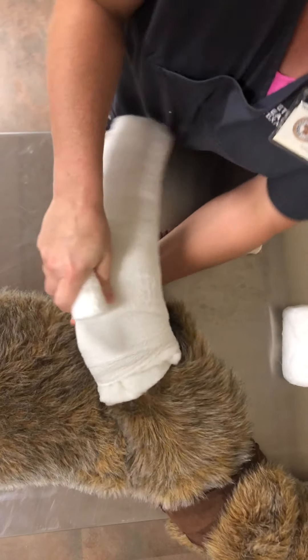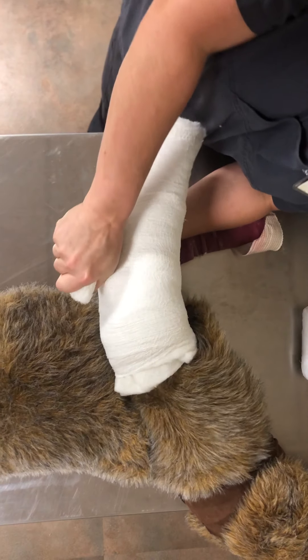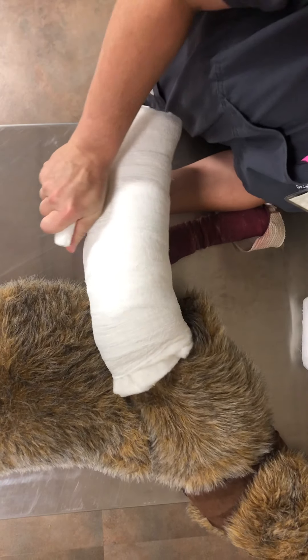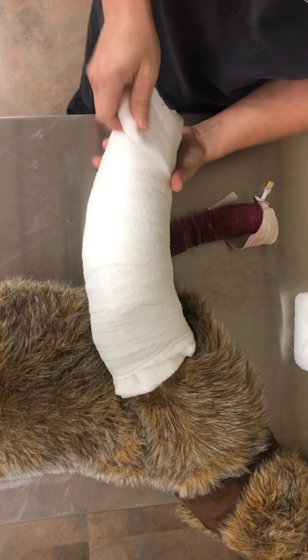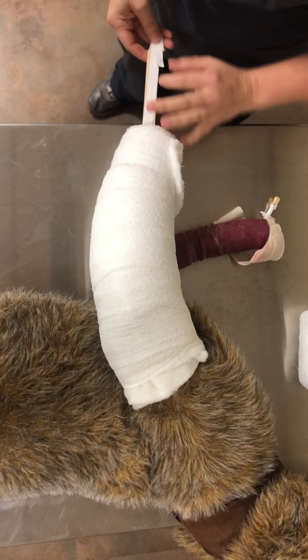I think we're doing pretty good here. Pull as tight as I can, all the way back down. I think we've got a pretty big bandage here.